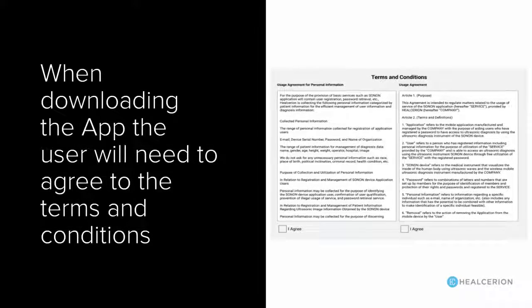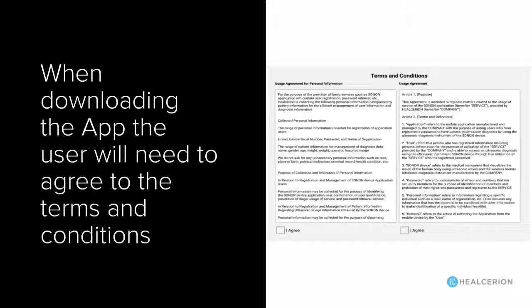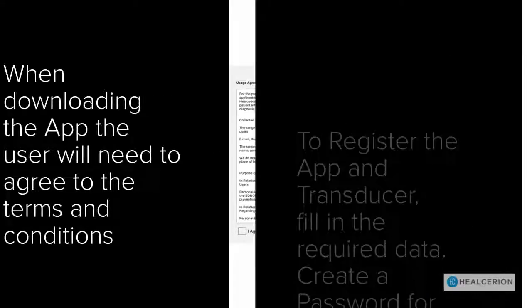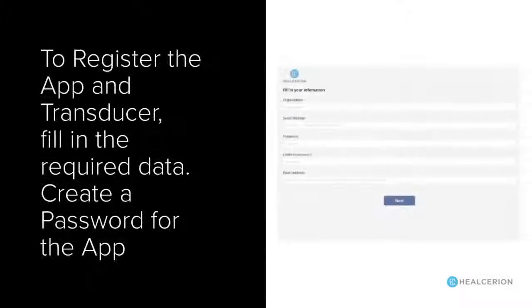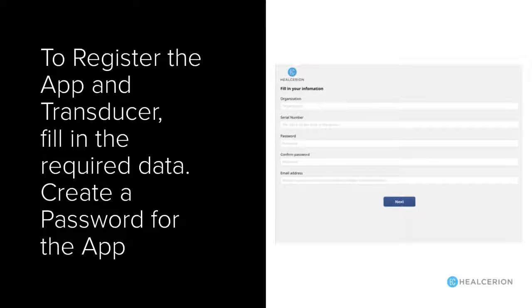You will need to agree to the terms and conditions of the app during the install. Go ahead and fill in the information required, including the serial number of the Sonon Ultrasound device.